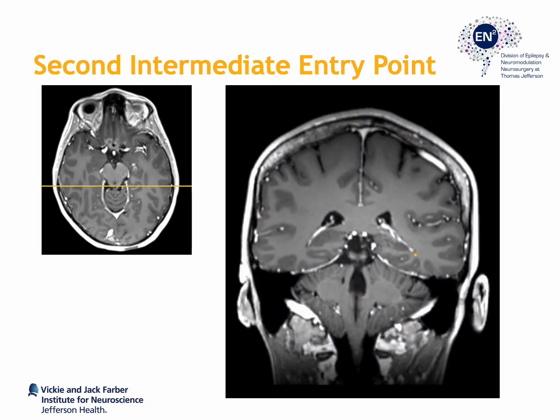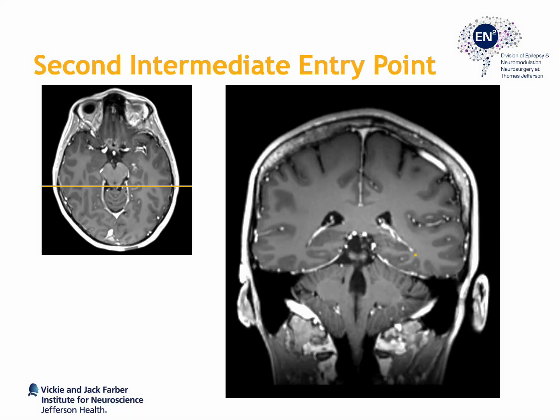The next task is to extend this entry point towards the cortical surface. We also aim to maintain a completely extraventricular trajectory. In order to do this, we must cannulate the corridor defined by the lateral ventricle superiorly and the collateral sulcus or occipital temporal sulcus inferiorly. This corridor typically serves as the most limiting portion of the trajectory. As we extend the trajectory posteriorly, I typically stop at the level of the tectum to identify this corridor and adjust the trajectory so it passes squarely through it.